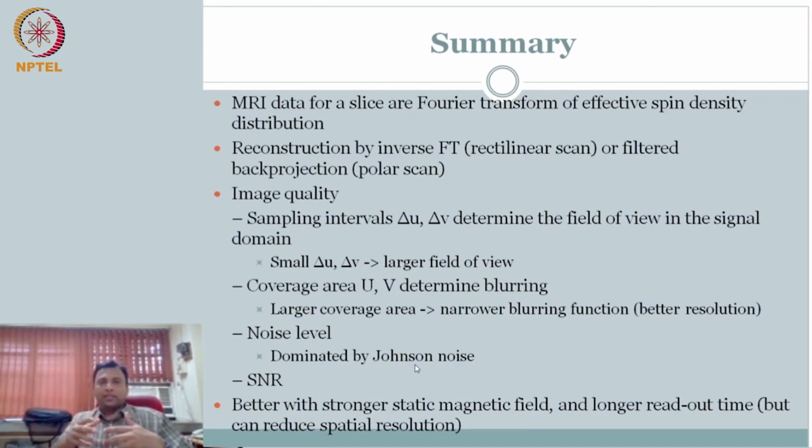Likewise in ultrasound, we send sound and you receive sound. Essentially we are characterizing the scattered signal, that is the echo that is coming back, at least in the echo mode that we covered. You send the pressure signal and it is scattered. How much is scattered from a particular location depends on the acoustic scattering property, which is related to acoustic impedance properties. So the reflectivity at each location is what we are going after.